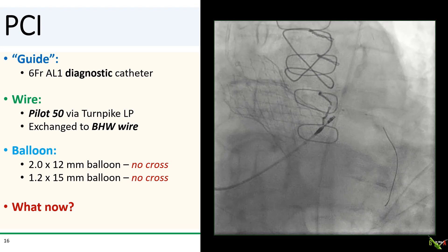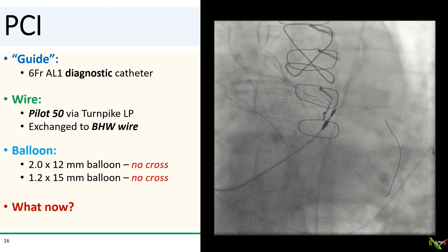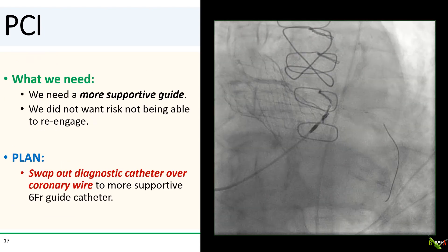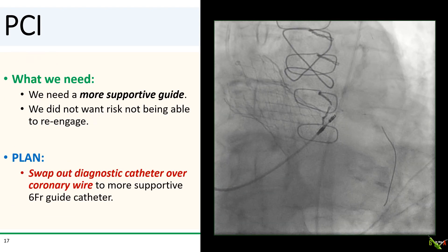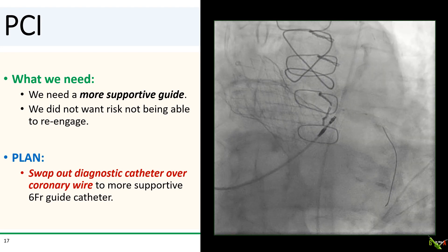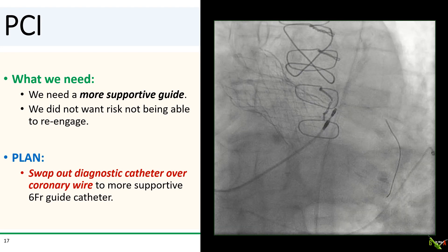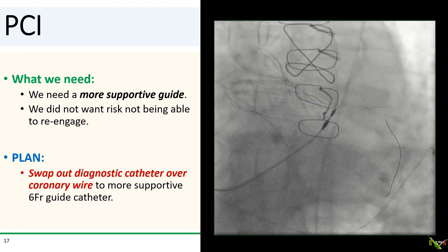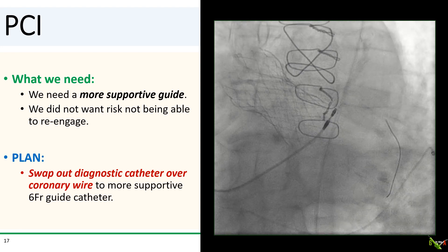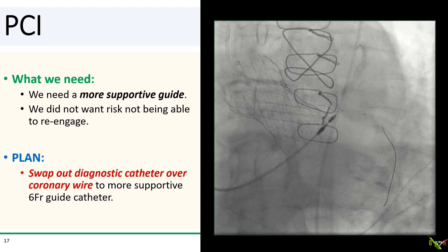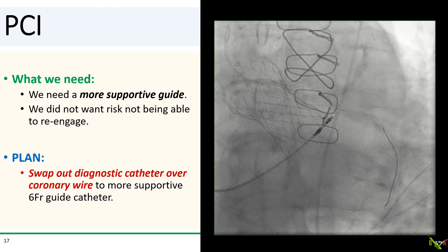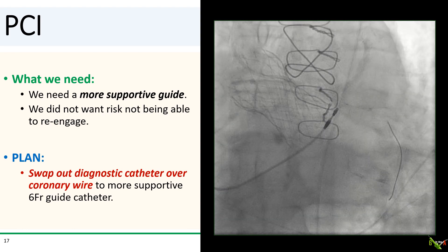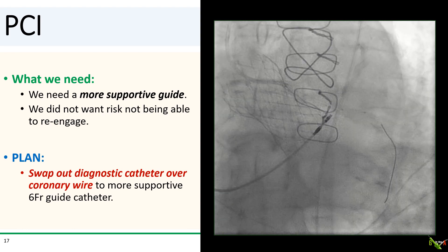So what do we do now? We already had a supportive wire, but the guideliner won't fit. Ultimately, I thought that what we needed was a more supportive guide—I was fairly confident that we could get through this lesion if we had a real guide and used a guide extension catheter. The problem was that I still was not confident I would be able to engage the left main with a guide catheter after disengaging our diagnostic catheter. So here was my plan: I was going to swap out my diagnostic catheter to a guide catheter directly over the coronary wire.